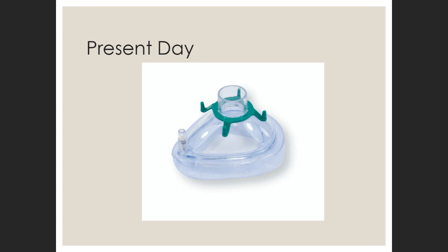Whose comment was that? Let me go back and see that one. Tell you, Miss Harvey. Expand, expand, expand. Give me a little more. What do you mean by in the right place? Because you're along my line, but it's not quite as precise as I would like it. Because it's a mask. It's over the face. So what does misting tell you, Daniel? Thank you, Sion, a patent airway. That's what it tells me.